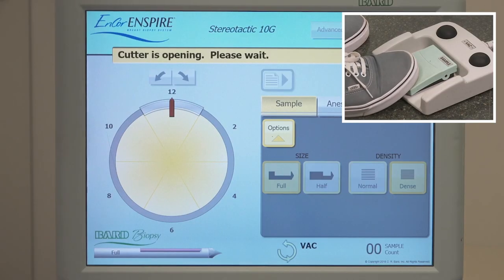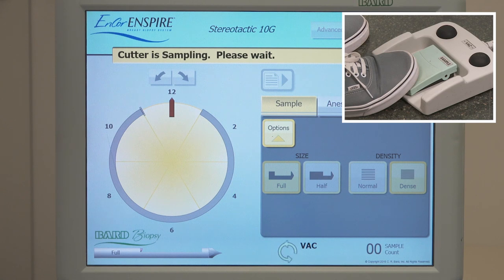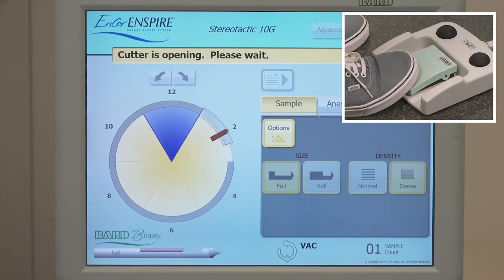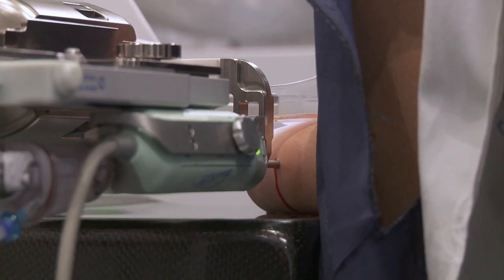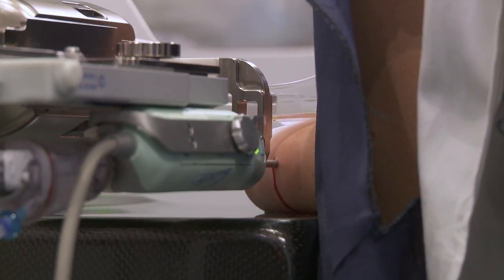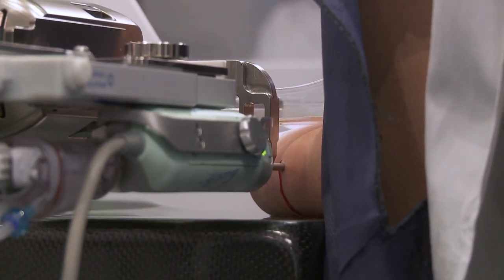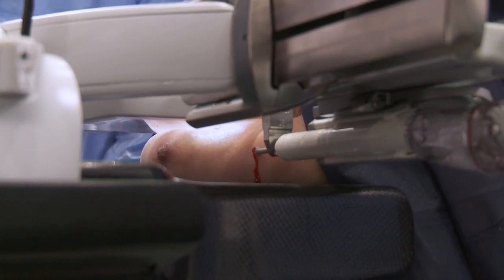Proceed with sampling. Full pattern, full notch, and dense tissue is selected.